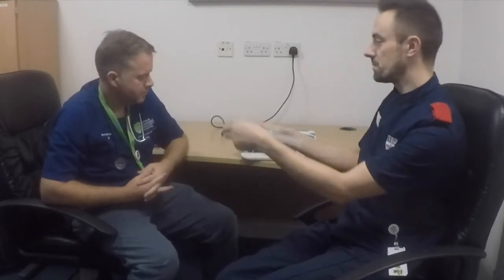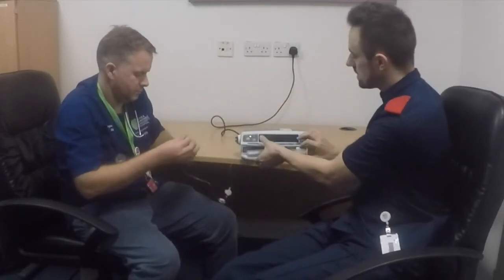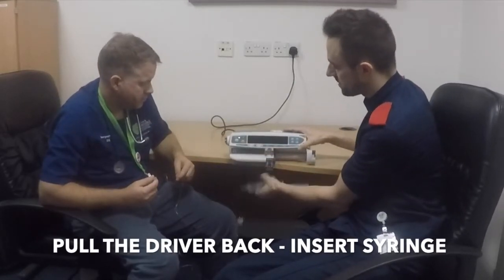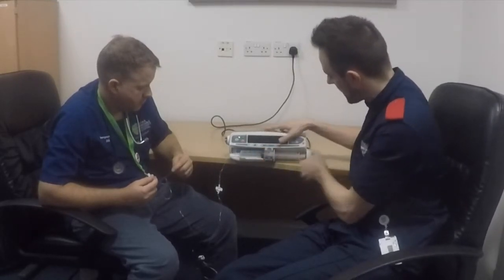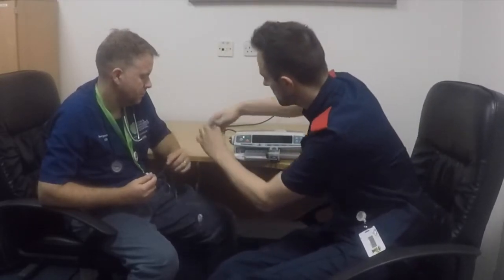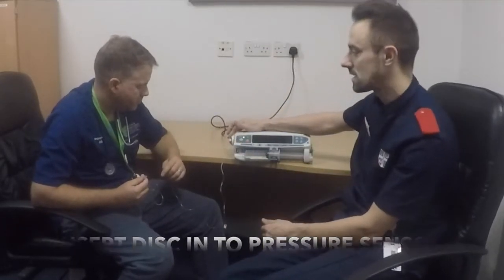So now you're ready to pop your infusion into the pump. Simply pull the driver backwards and open the clamp. Pop the syringe into the clamp and bring the driver down to the end. The next thing you should do is make sure that you've slotted the pressure disc into the pressure sensor at the side.